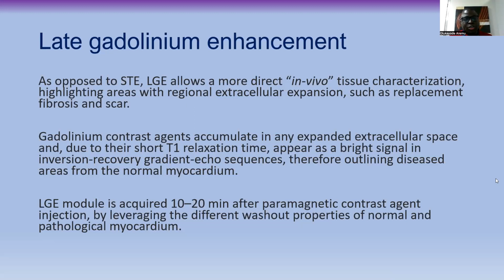So when you put your patient in the scanner, remember that the protons we have in the fluid of our body are already in Brownian motion. The protons will align with the magnetic field of the cardiovascular magnetic resonance scanner. When they align like that, you introduce your radio frequency.